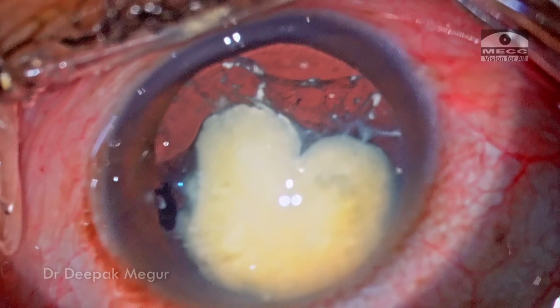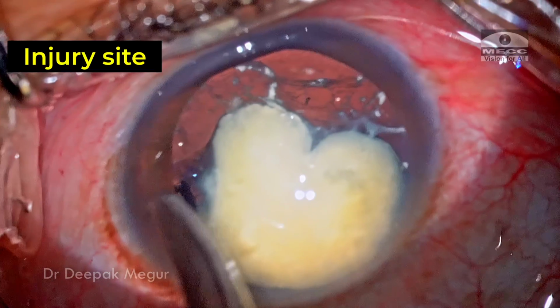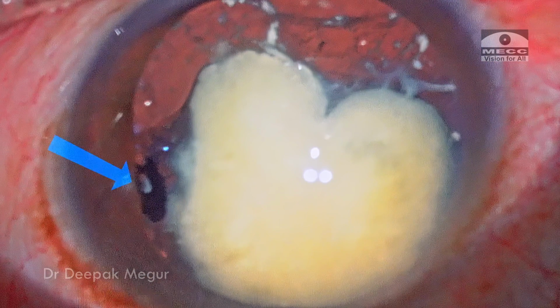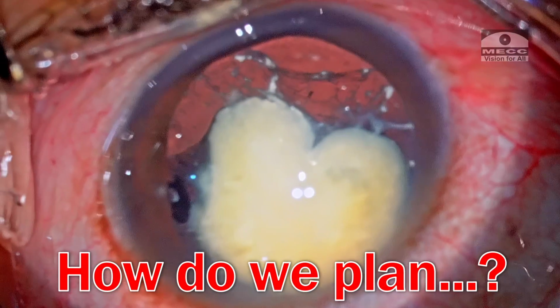And as I come back to the cornea, there is an area of opacity. That's the site of the penetrating injury from which the stick has entered and come out. Okay, now this is the case. How do we plan surgery in this eye?